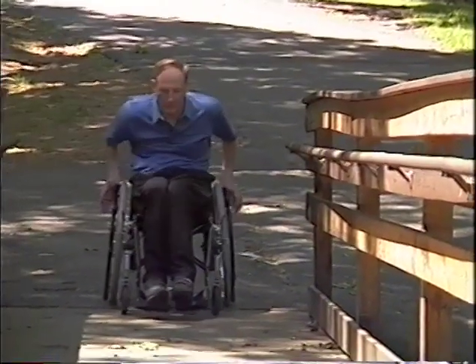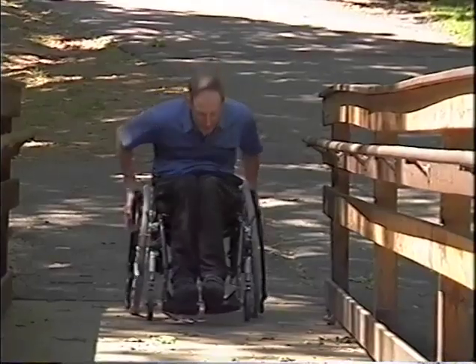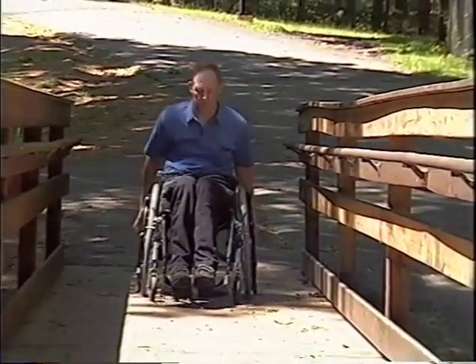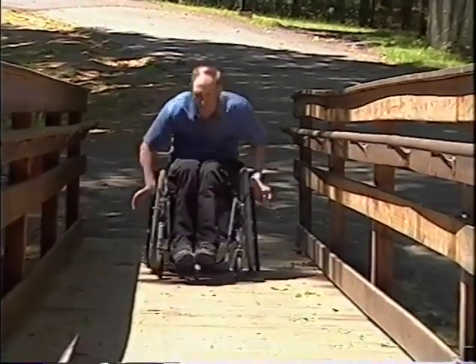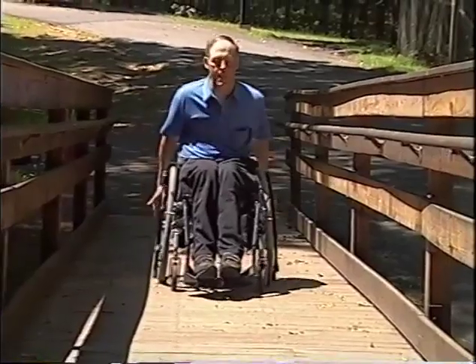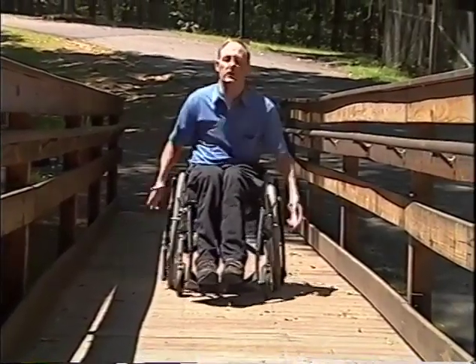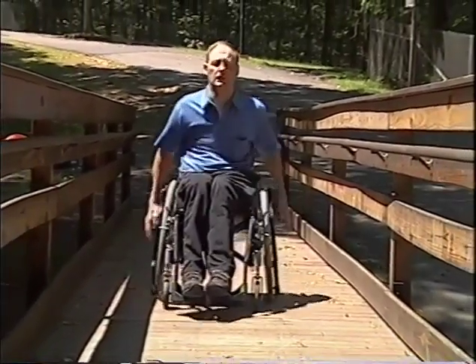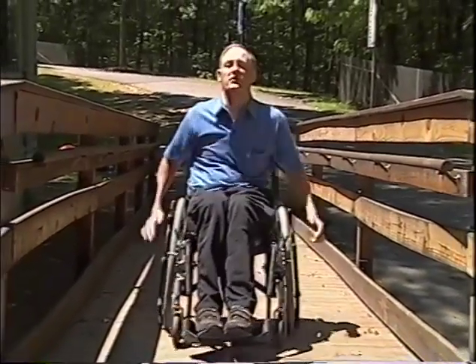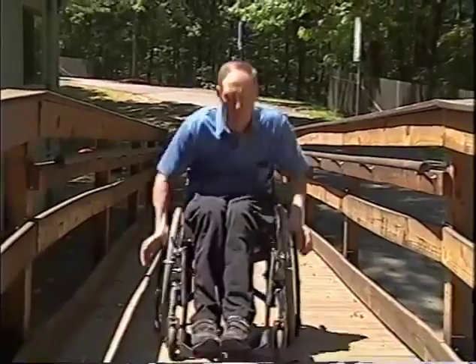So coming up, get your weight as far forward as you can, and your biceps are your best asset here, so really try to get them into it as much as possible. I'm trying not to use my triceps very much here, but my injury is a C6 injury, so take heart.